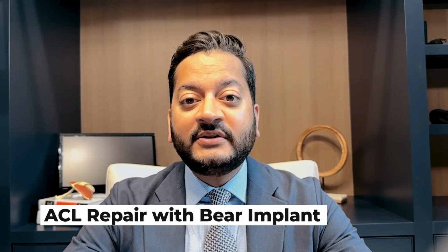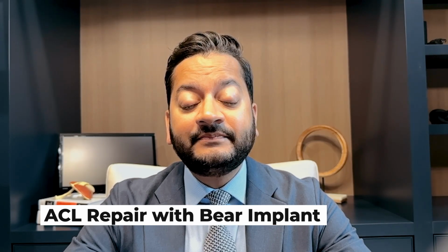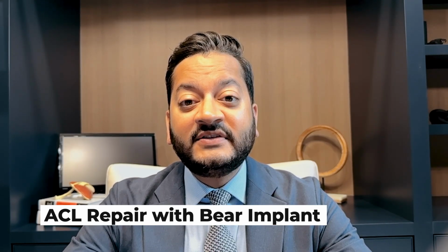I'm going to talk to you about the ACL repair with the Bear Implant. Historic methods of attempting to repair or suture an ACL ligament that's been injured have failed. Whether that's using strong suture material or other synthetic materials, the body lacks the ability to heal the ACL. The Bear Implant is relatively revolutionary in this.